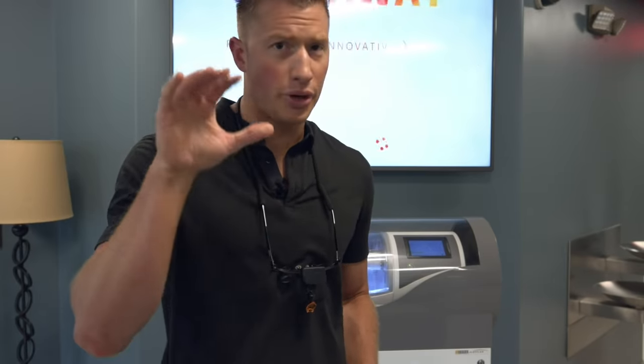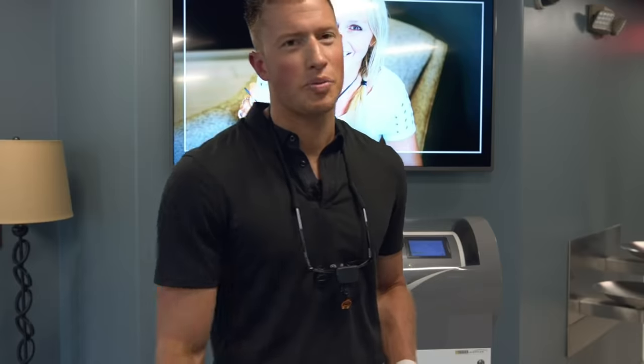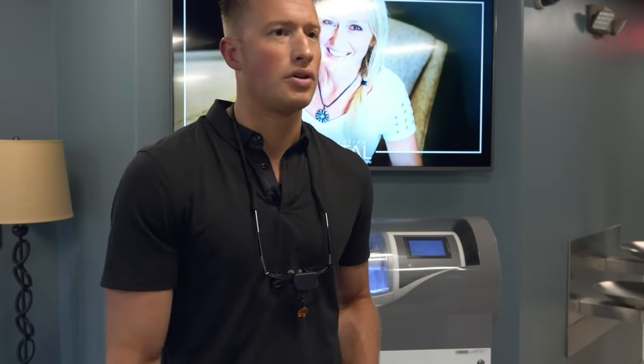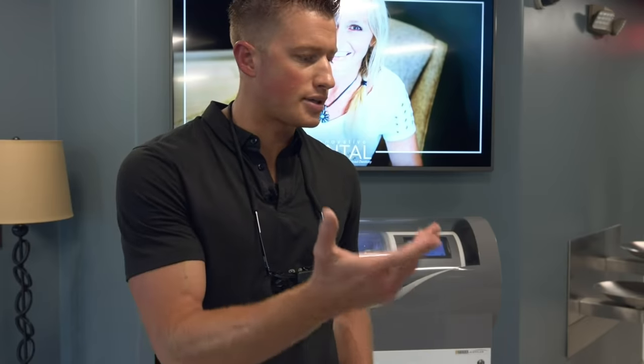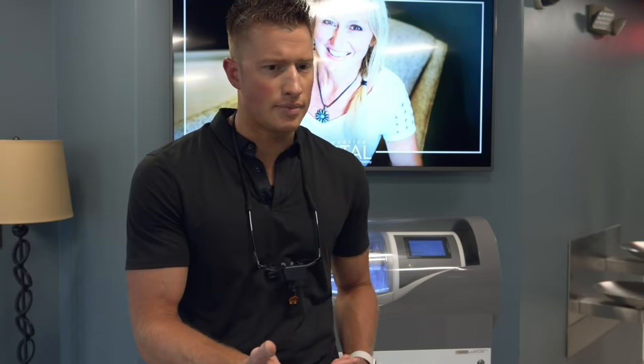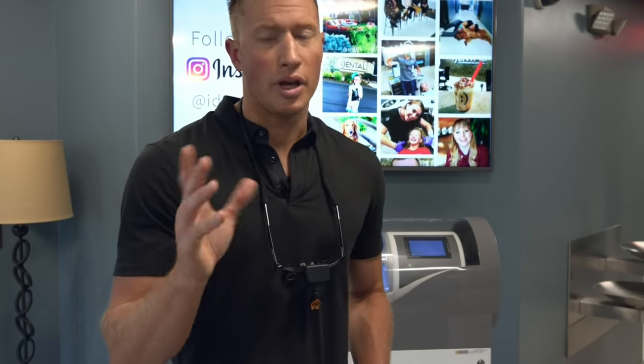So while implants are pretty darn strong, if they're not placed correctly, it doesn't matter how strong we place something, the forces we place in our mouth consistently for decades can cause a lot of issues. So we had an implant a couple weeks ago that a patient had done at another office a while back, and the implant broke, and upon inspection, there was no bone on the side of the implant, so no support.